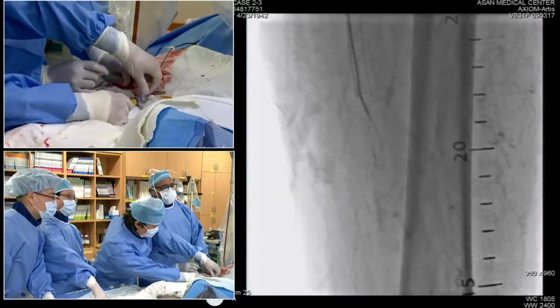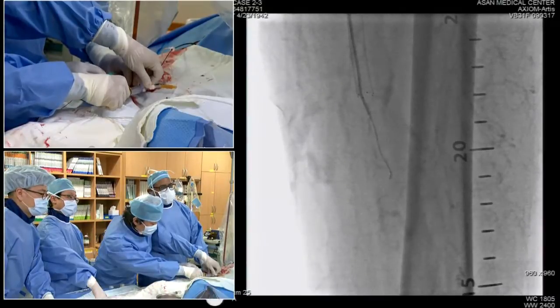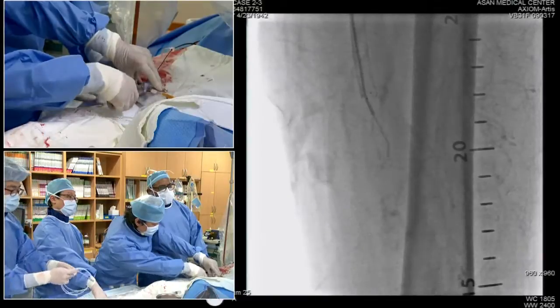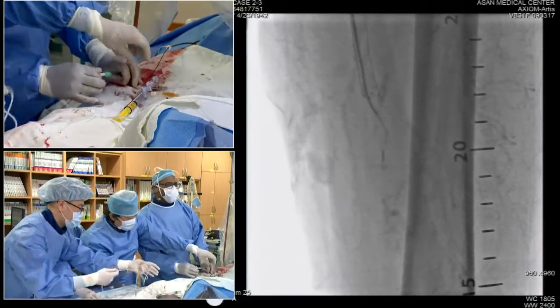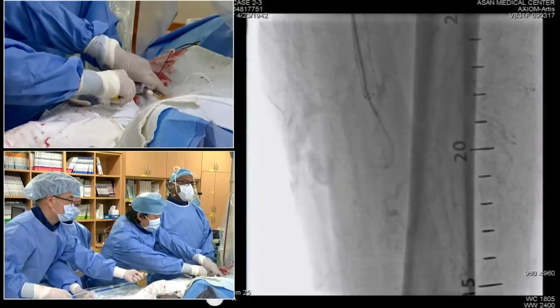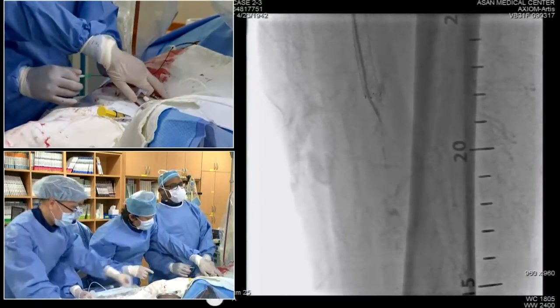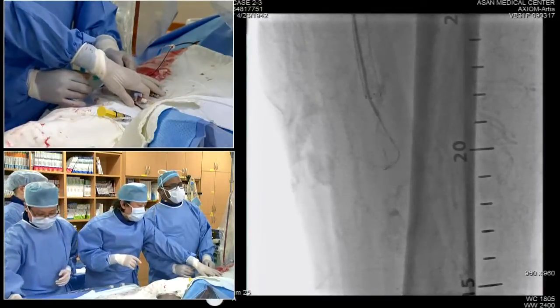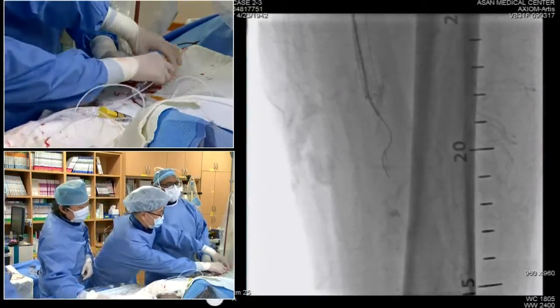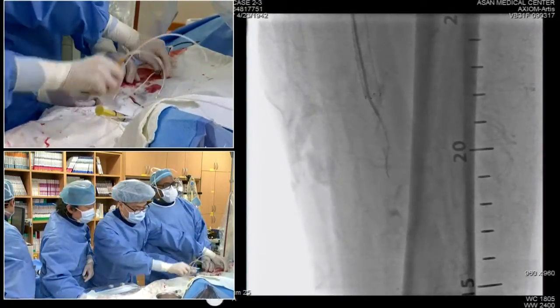What's your advice? My approach would be to take a re-entry catheter at this point. I'd probably dilate the stent in the proximal vessel to allow it to be delivered more readily, and then I would use the Outback to re-enter, right there. Because I don't think we want to extend the dissection down much further here. Well, I do agree, because the larger you make your dissection, the longer stent you're going to need. So you just make your lesion much longer. Yes.